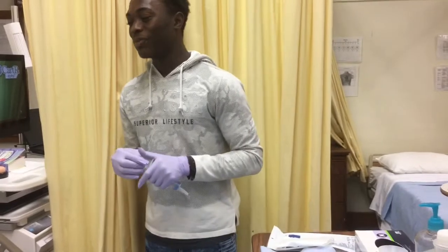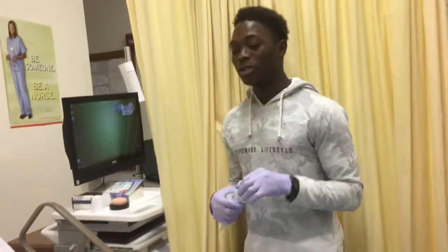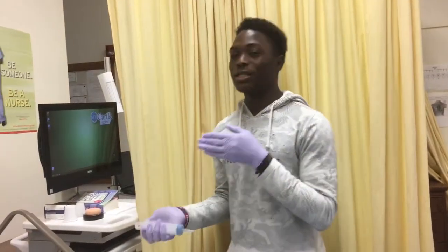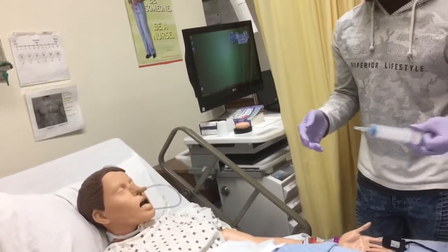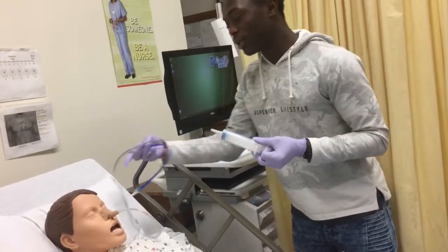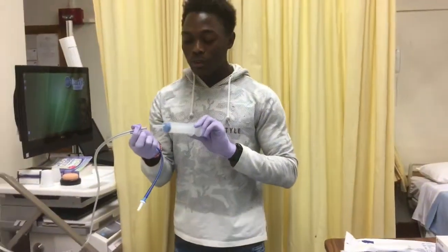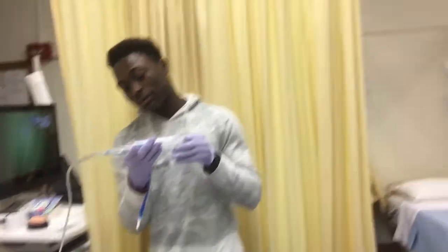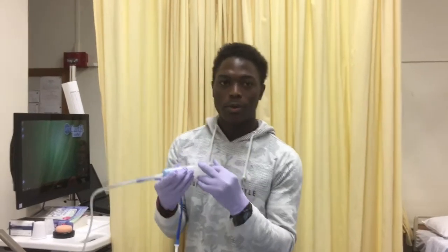Every time you're inserting a tube and you notice that the patient starts to cough or that O2 sat decreases, you want to remove the tube because that's a clear indication that it's in the lungs. Okay, so now I am gonna come in. My doctor has ordered 300 milliliters of milk, a full liquid diet, for my patient every 4 hours. So to do that, you want to check for placement of tubing. Okay, that seems good, and now you can put it back in.